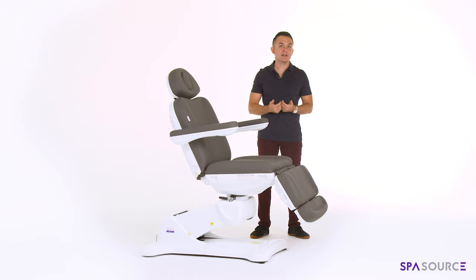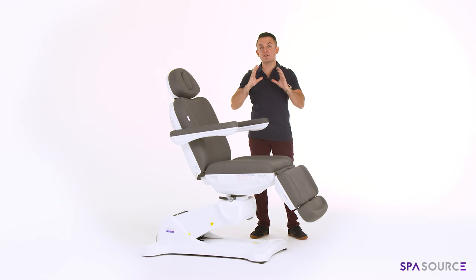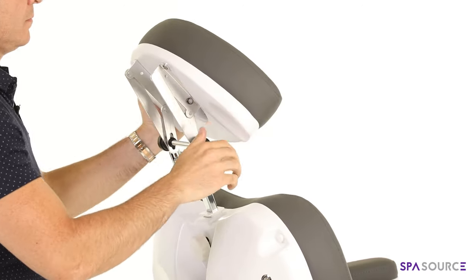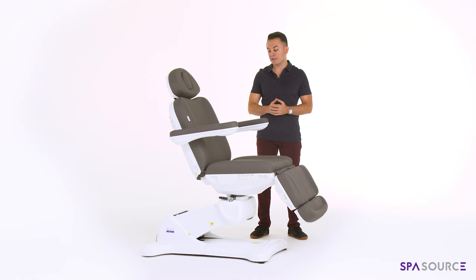In addition to that, the chair sports a fully articulating headrest, meaning if you have any treatment that requires the patient to be in a prone position — facing down or really anything in between — you can utilize the articulation of the headrest to get that done.